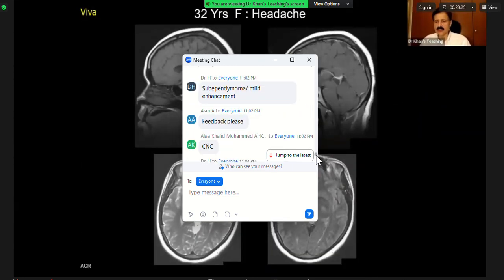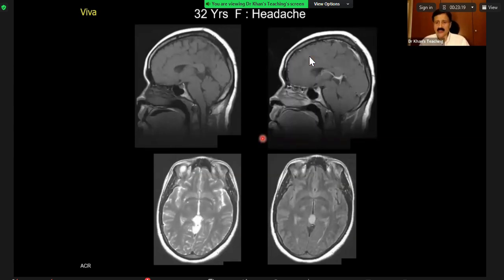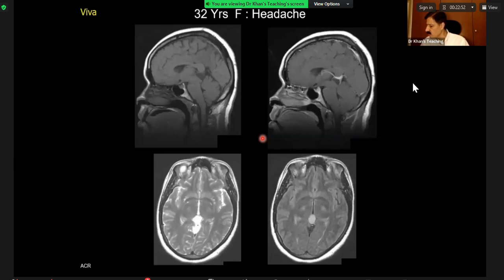Okay, we have got two differentials to go. One is pineal lesions. Another one is CP angle. The third and the last thing which is left here is meningeal enhancement, or meningeal lesions. Meningeal lesions we had already covered in the previous section. So for today, two differentials are left. One is pineal and the second one is CP angle. Though we are running out of time, I think we will just crack on and in 10-15 minutes finish them. So over to you.